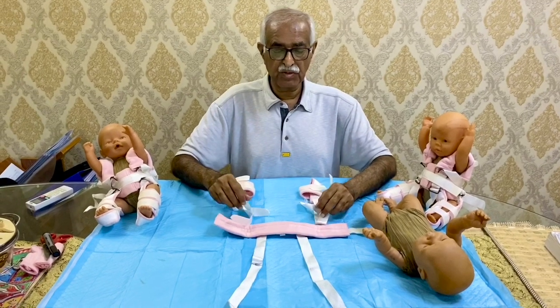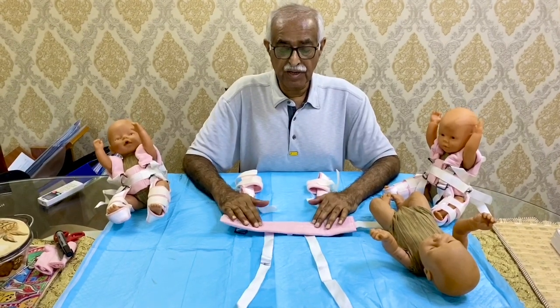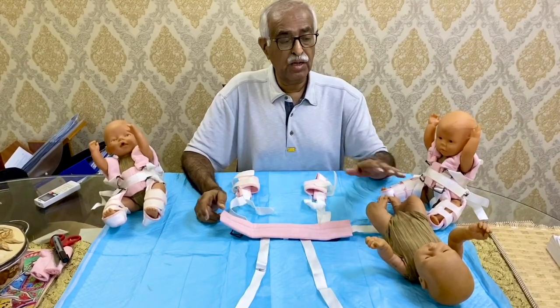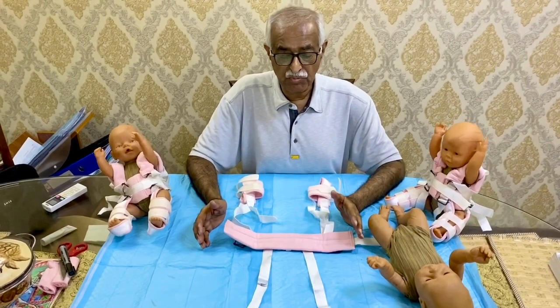Bismillahirrahmanirrahim. I am demonstrating today the Pavlik harness application on a model of a baby, which is called the Pavlik harness module.